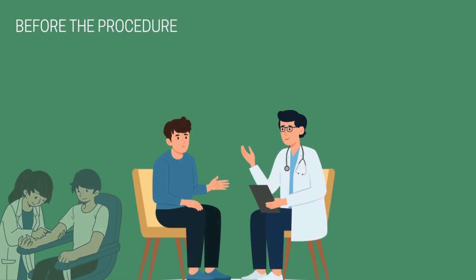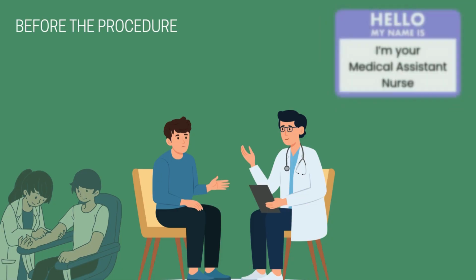Before you draw any blood, take a minute to slow down and focus on the patient. Start by checking that the environment is clean, calm, and organized. If possible, position yourself at their level, as standing over someone can feel intimidating. Greet them warmly by their full name and introduce yourself. "Hi, I'll be drawing your blood today." Use a calm, steady tone and make eye contact. If they seem nervous, it's okay to say something like, "It's totally normal to feel a little anxious," and tell them that you will walk them through everything.